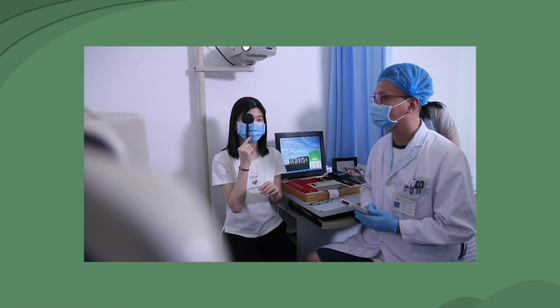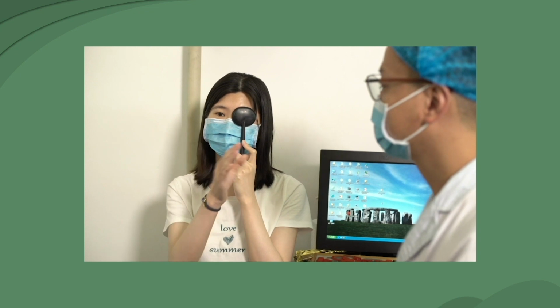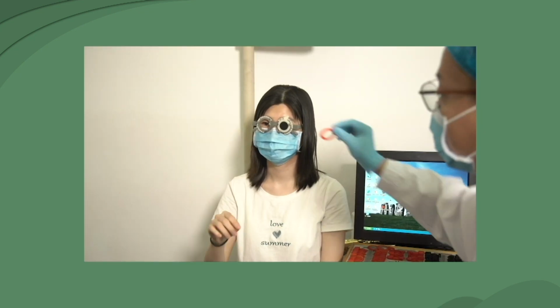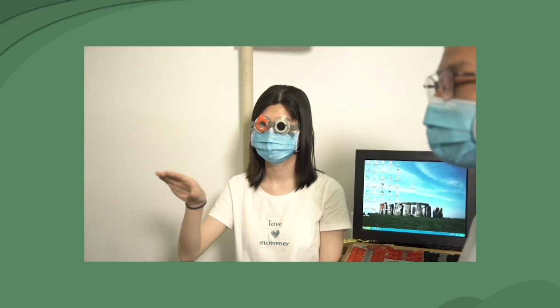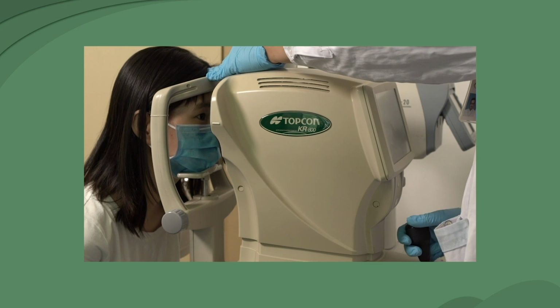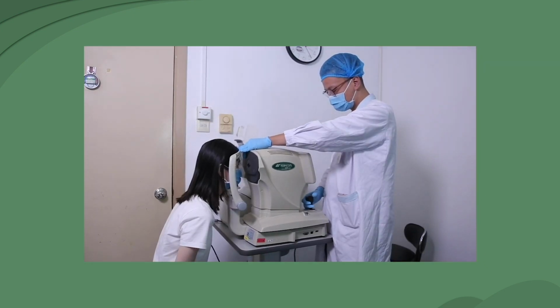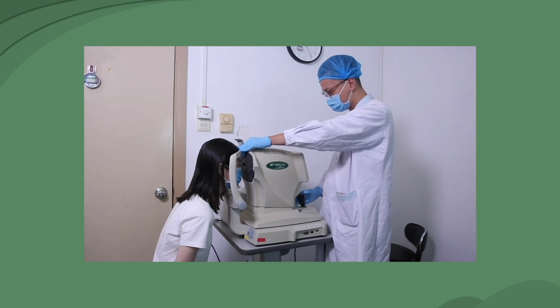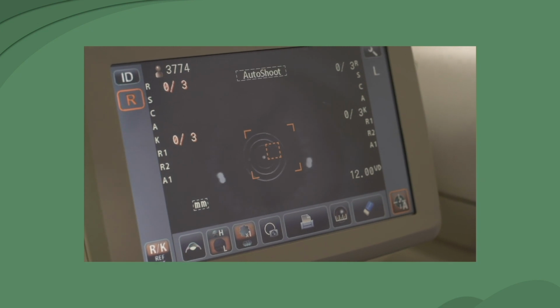Visual acuity is measured firstly without glasses. It is uncorrected visual acuity, or with the aid of lenses, corrected visual acuity. Accurate assessment of refraction can be achieved by subjective or objective means, and is best accomplished by a combination of the two methods.